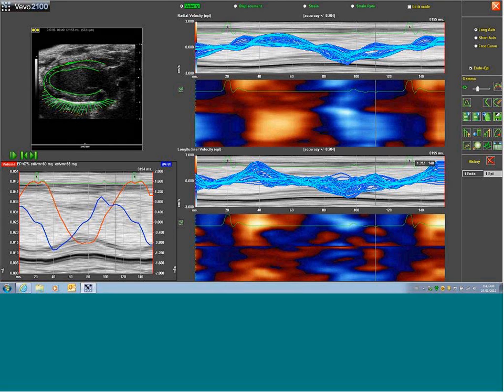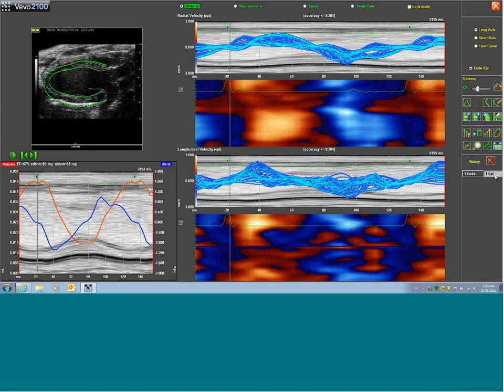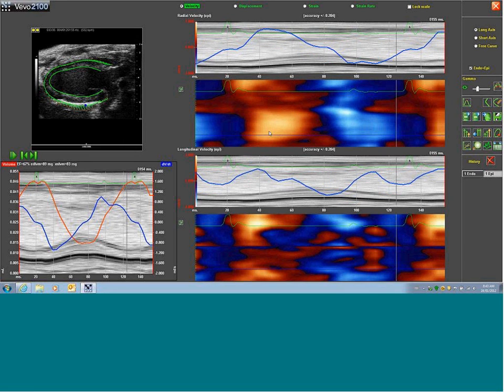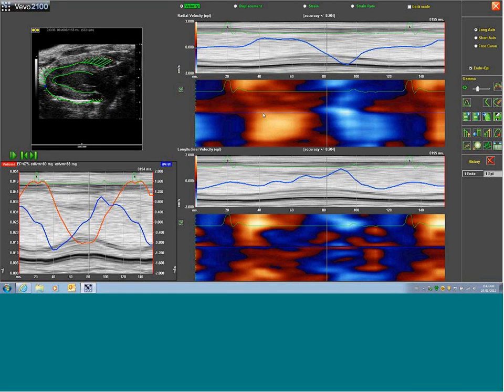To get epicardium analysis, at the bottom right-hand corner, you just hit epi. The option is endo 1, which is tracking the endocardium. You can select epi 1, and now it shows you the vector or movement for the epicardium. And again, you can collect data for the epicardium by selecting that button. That's a very good question, and one some people sometimes miss.